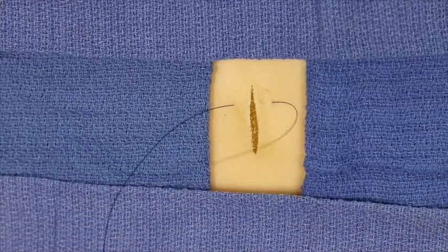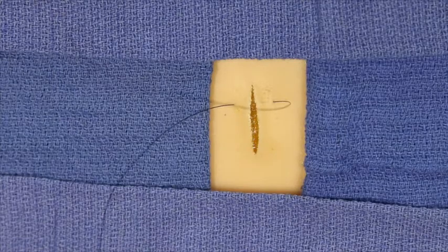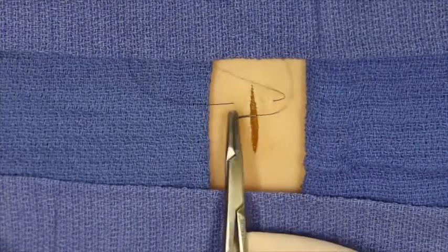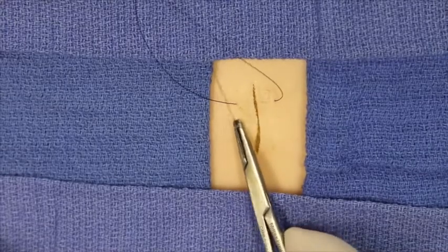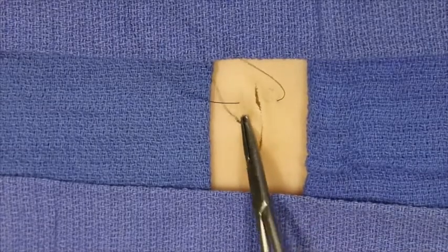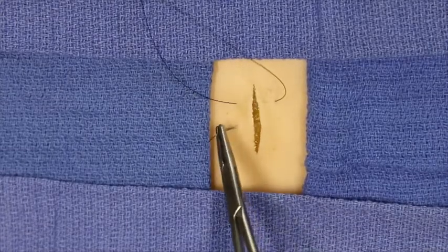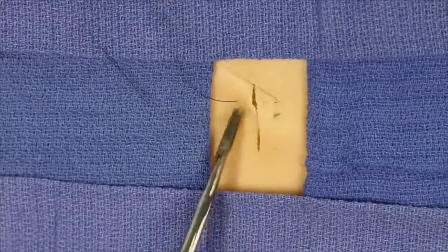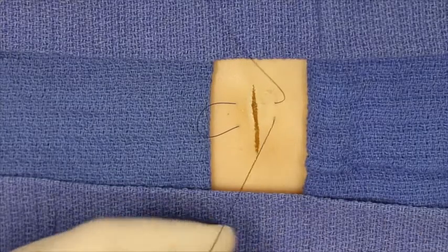The needle is then reloaded with a backhand technique, inserted again at 90 degrees and exits on the contralateral side. At this point a horizontal mattress suture has been placed.